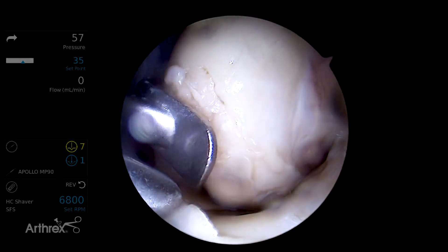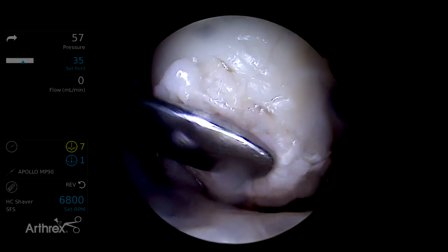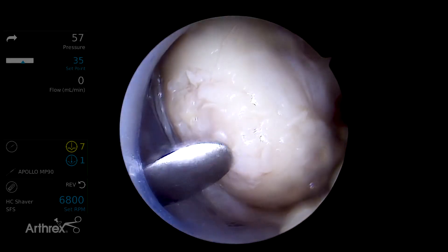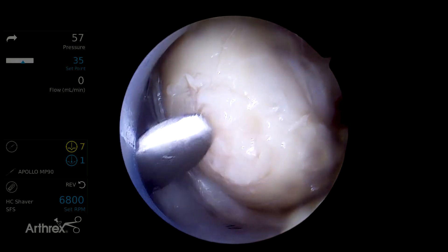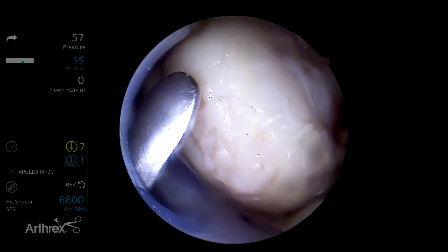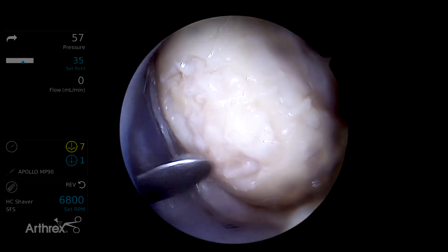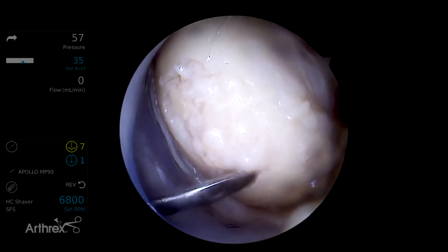Next, we'll introduce the graft. You want all the soft tissue away from the lesion so you can manipulate the graft with a freer. In this case, we used an accessory portal with a freer elevator to help manipulate the graft outside of the introducer. It's a dry field, and once the paste mixture is applied to the defect, we use an autologous-based fibrin product to glue over the material.